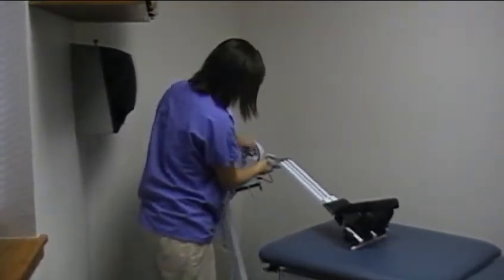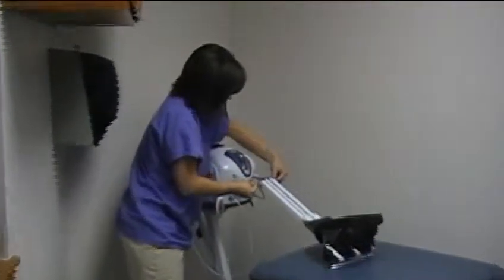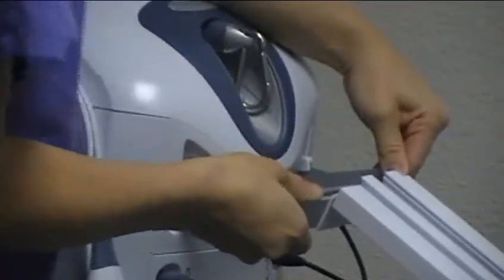Right here on the front, you take this, push it in, then down, and then it'll be in.